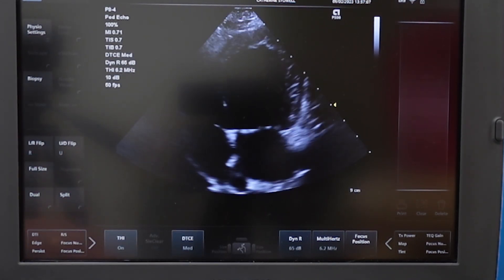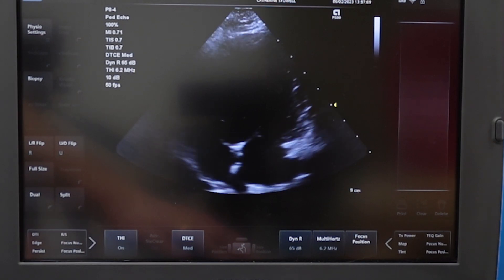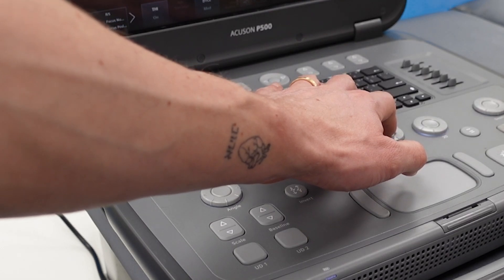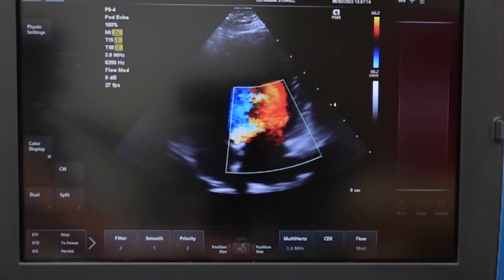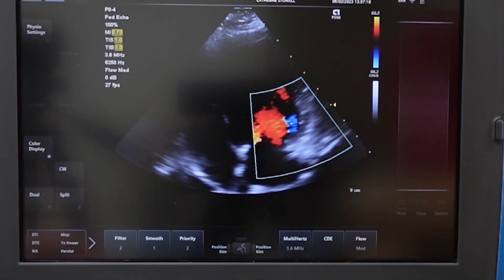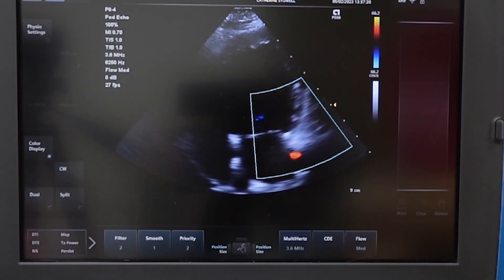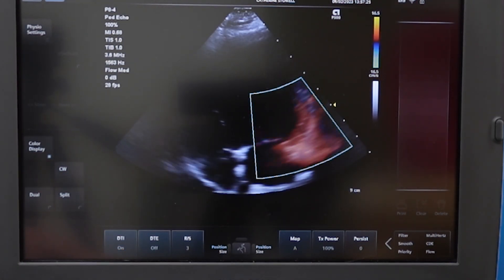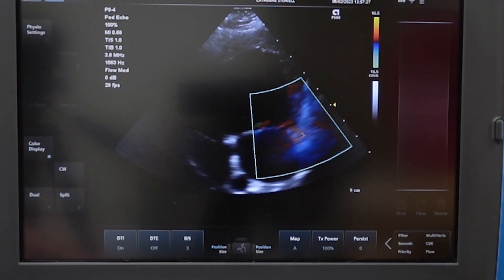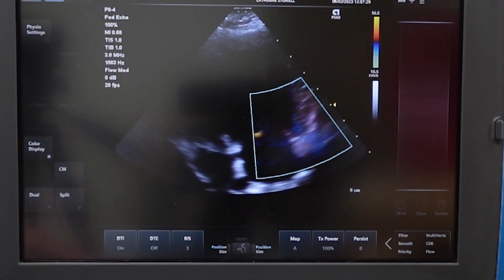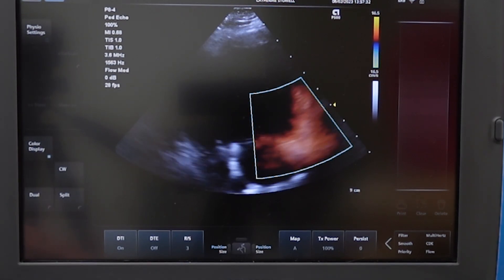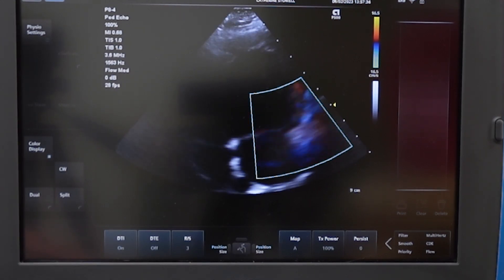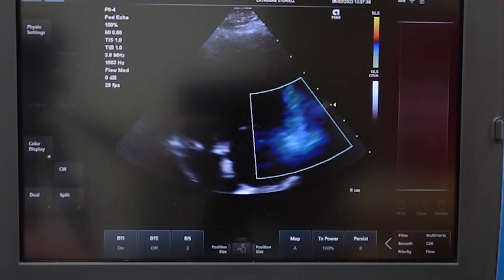To start with for TDI we can put a TDI map on. To do this we hit color, which will bring up our color map. Simply move it over the area of myocardium you want to measure, and on this system we just have to change the map to the TDI map. Now what we will see is the color map is picking up myocardial velocity and not blood velocity. Anything red is moving towards the probe and blue is moving away from the probe.